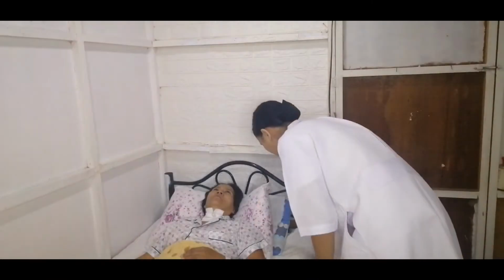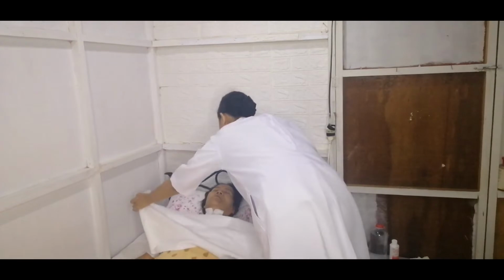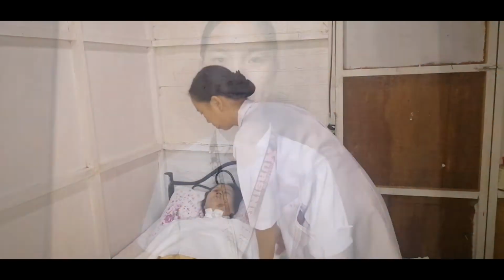Place the towel below the trachea site, covering the neck and chest of the client. Put on face shield or goggles and mask. Suction tracheostomy if necessary. If tracheostomy has just been suctioned, remove soiled site dressing and discard before removal of gloves used to perform suctioning.